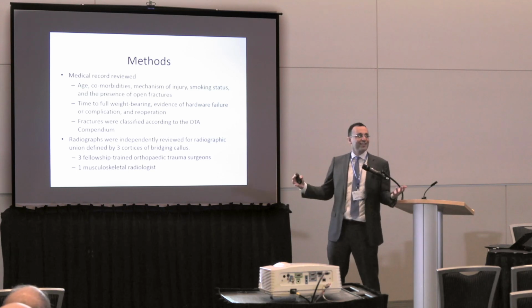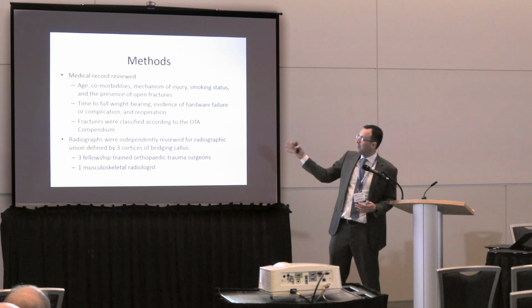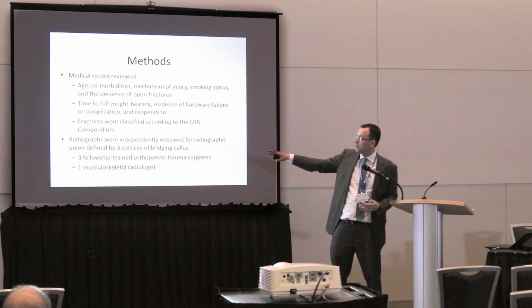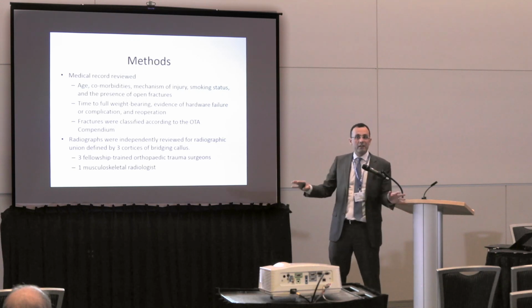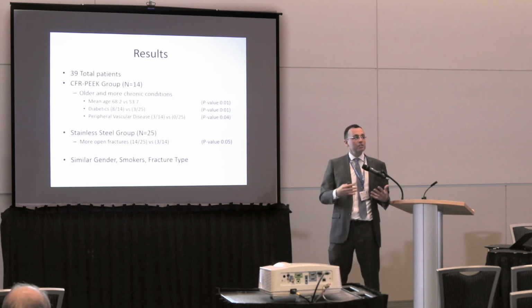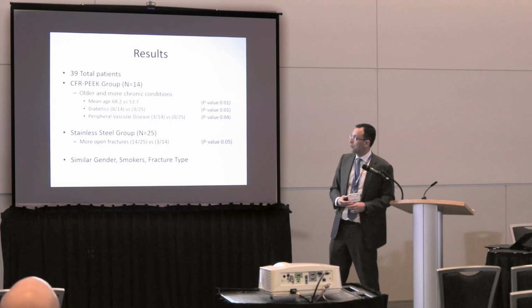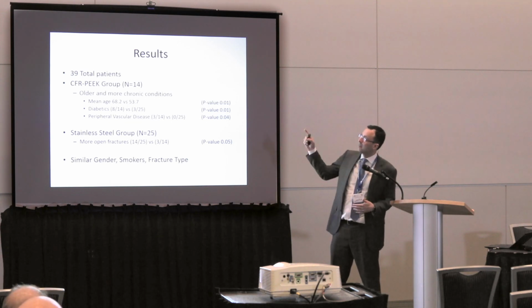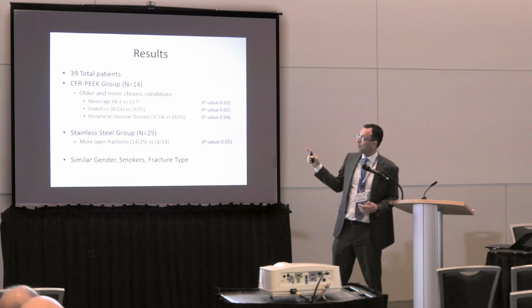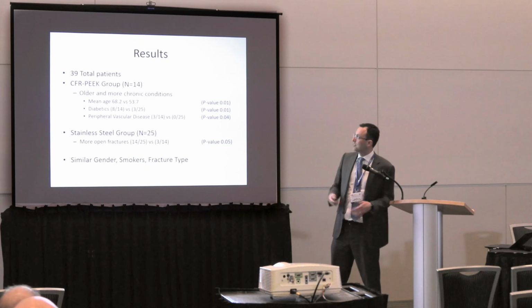Just like any good study, I'll tell you the methods. We went through and looked at all the medical records, looking for all the things you normally look at, and then I wanted to be honest with myself and look at the radiographs. I, as well as 2 other fellowship-trained orthopedic trauma surgeons and a musculoskeletal radiologist, independently looked at our results, and the results you'll see came from that. We found 39 patients, 14 in the CarboFix group and 25 in the stainless steel group. The carbon fiber group were older and had more chronic conditions, while the stainless steel group had a little bit more open fractures. Very similar, though, in gender, smoker type, and fracture type, so a pretty good match.